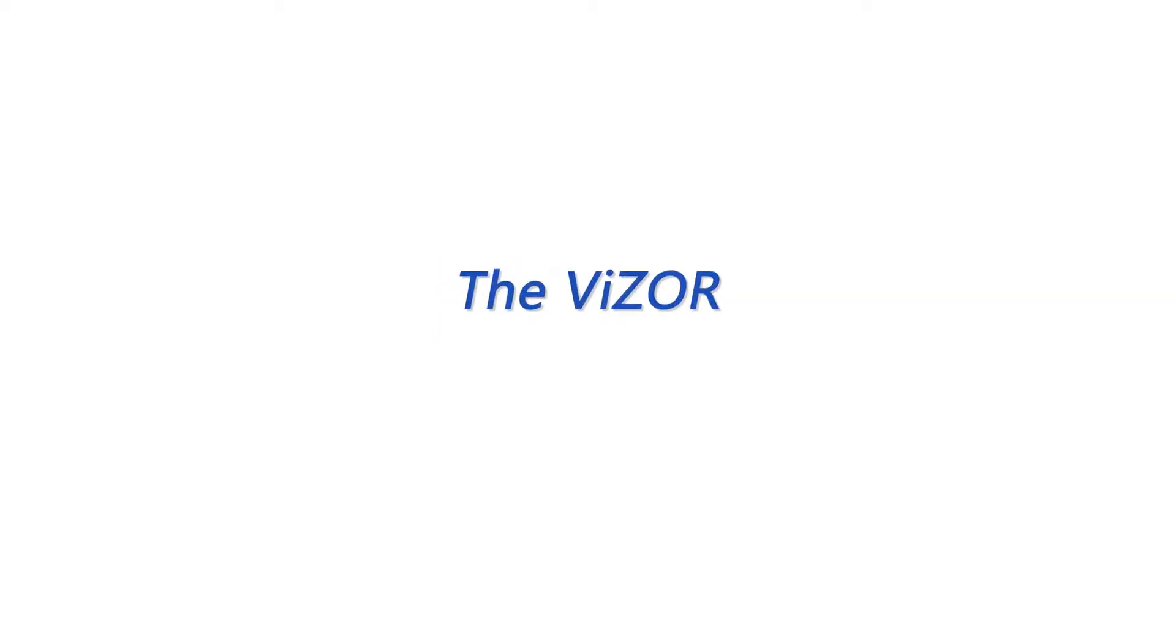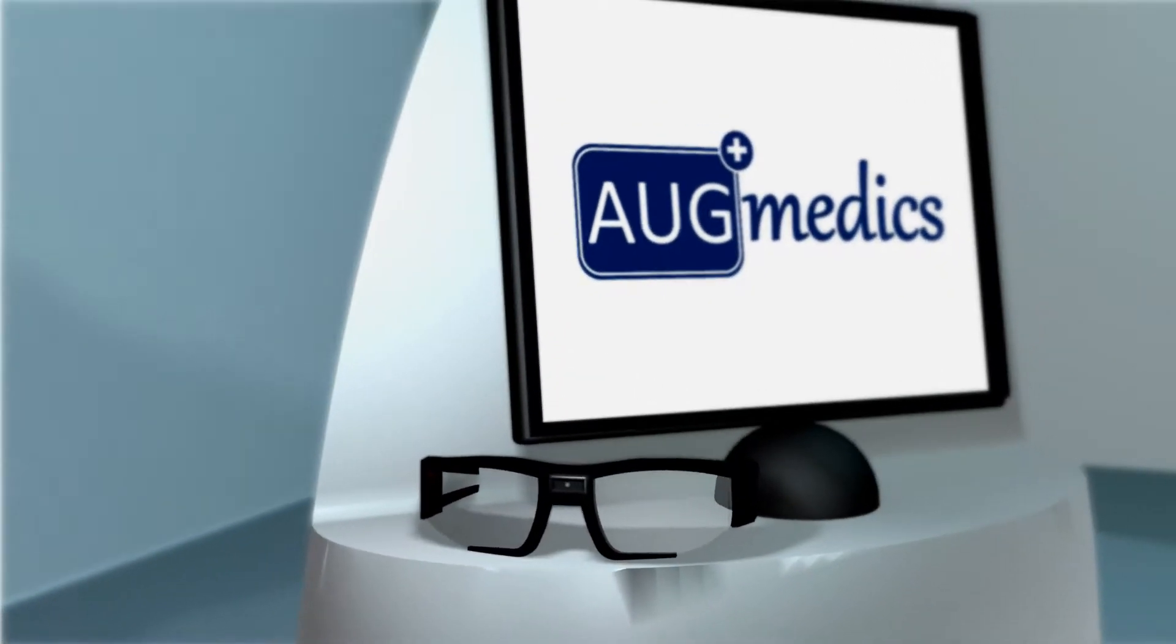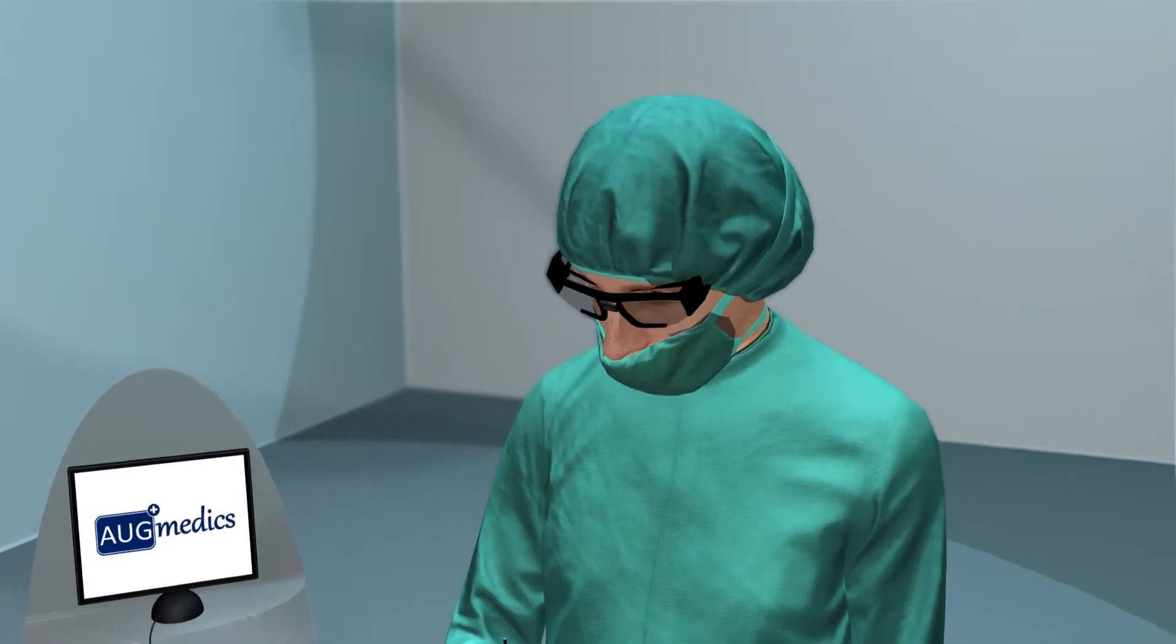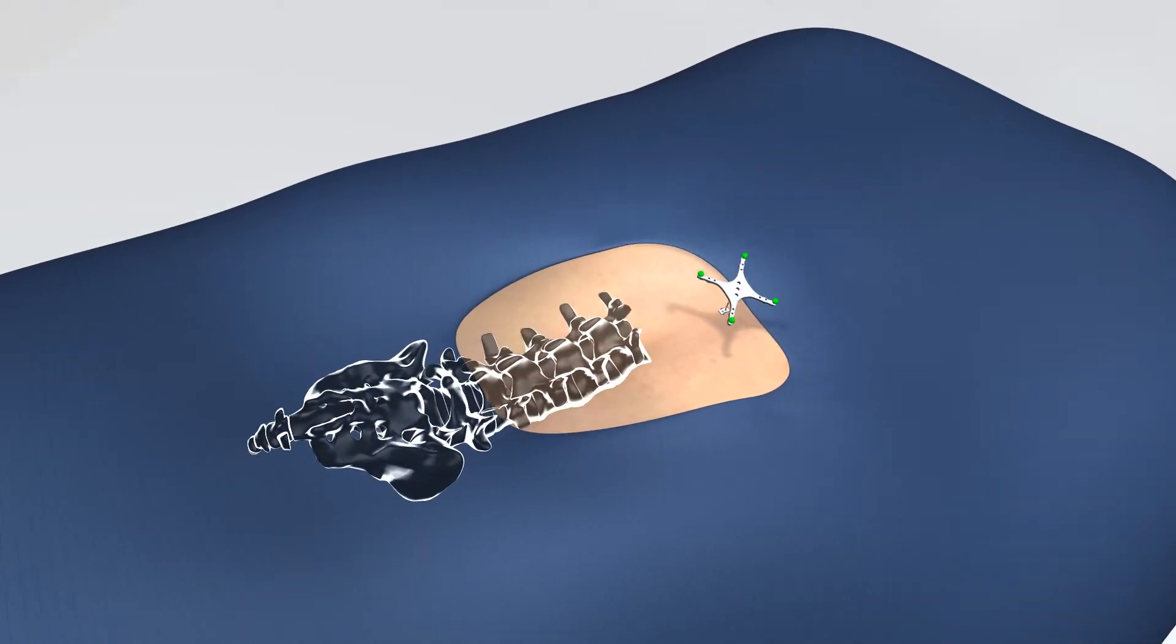Augmedics introduces the ViZOR, an augmented reality head-mounted display for spine surgeries. The ViZOR allows surgeons to see the patient's anatomy through skin and tissue, just as if they had x-ray vision.